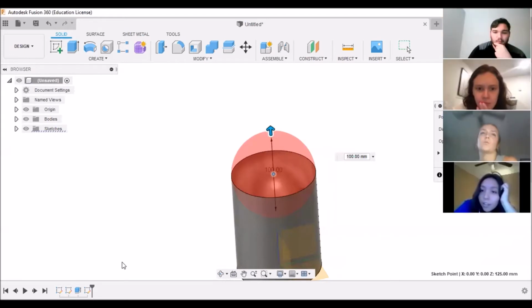Oh, since it's in cut, it's not going to make a circle. It's just going to make a cut into the cylinder. Exactly. And so there are different operations that we can choose.